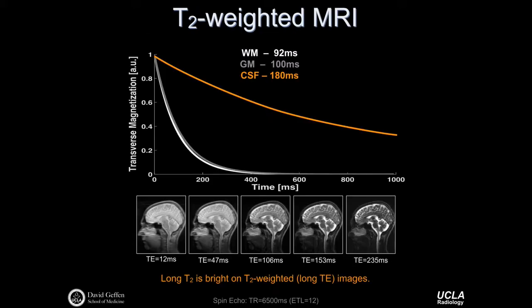So here we can examine what happens to the transverse magnetization during a T2 weighted MR experiment. So picture, if you will, that all of the bulk magnetization points along MZ at equilibrium. But after the application of an RF pulse, specifically a 90-degree RF pulse, what we call a saturation pulse, the transverse magnetization will go from 0, which it is at pure equilibrium, to being fully the maximum available amount of transverse magnetization. Here we just indicate a normalized value of 1.